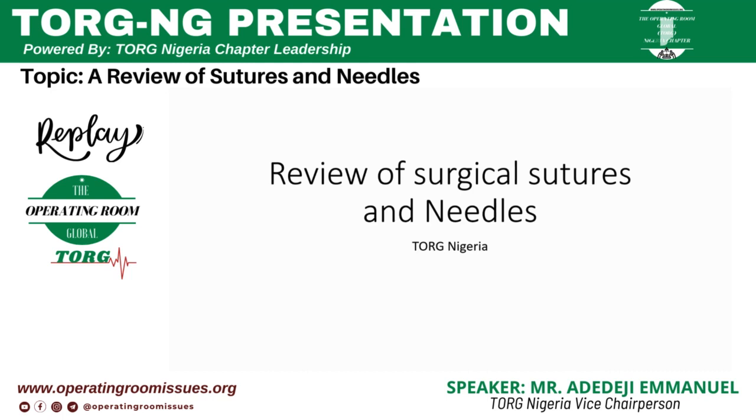Of course, that has to do with repair of surgical incisions, and we use them to anchor drains, from NG tubes to central venous catheters to abdominal drains and chest tube drains.